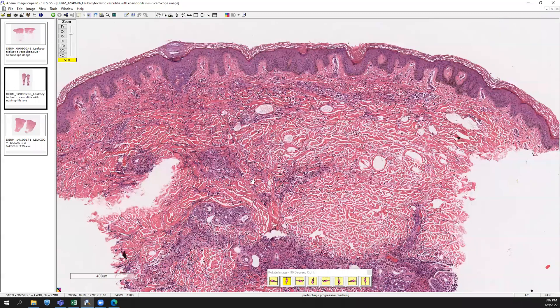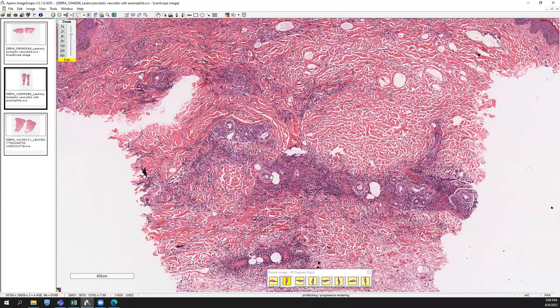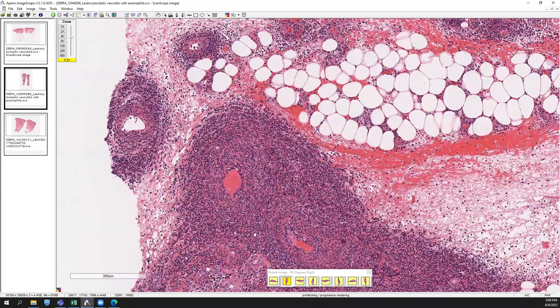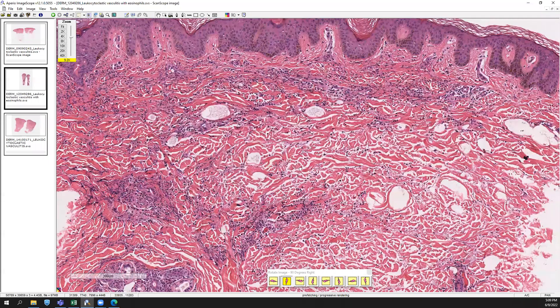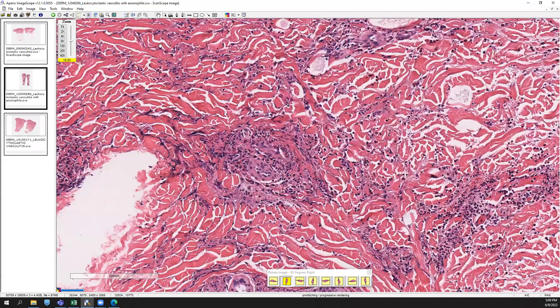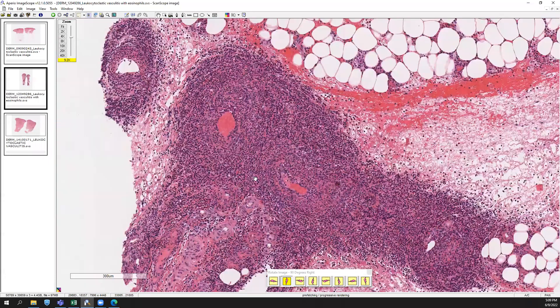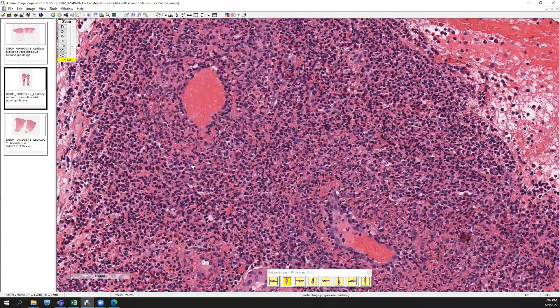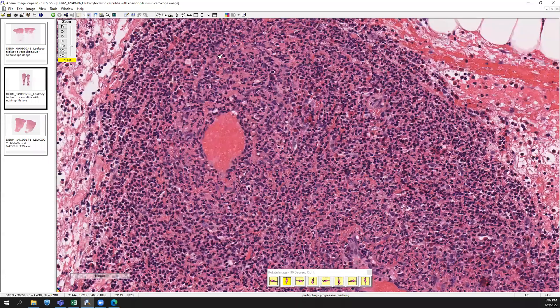This LCV inflammatory pattern affects the superficial and the mid and in some cases even deeper vessels, which may be larger caliber. The leukocytoclastic vasculitis in the superficial part of the biopsy is what you're going to see as a more classic leukocytoclastic vasculitis. But when you have a pattern of LCV with deeper inflammation that may even be affecting larger caliber vessels, you can think about some type of small and medium vessel vasculitis.